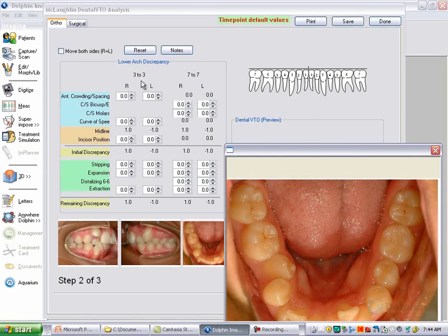This is important because it gives us information on what direction and how far we have to move our lower canines at the bottom of the column. And that's going to really start our third chart, which is a complete look at the tooth movements in the upper and lower arches. So let's take a look at what we have here.